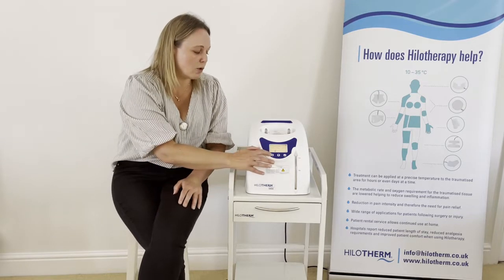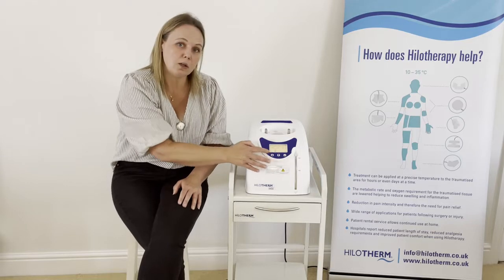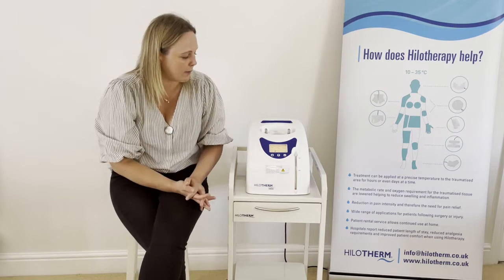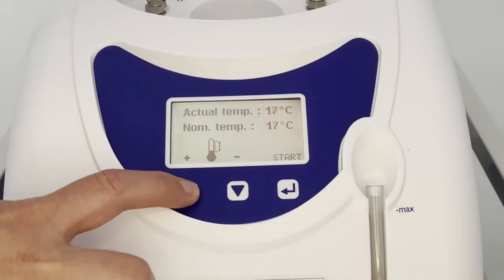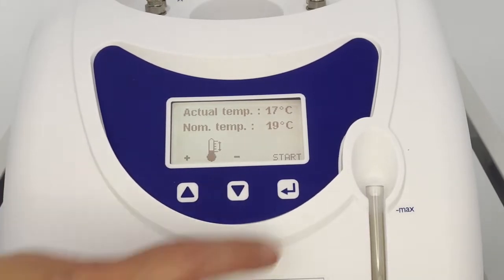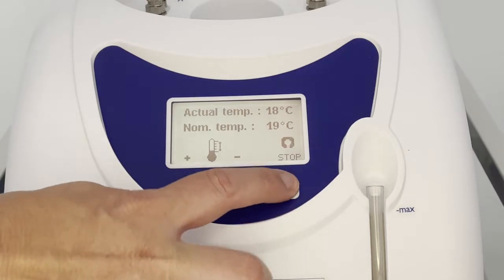You adjust the nominal temperature by increasing and decreasing it using the arrows. It won't work outside the overall range of 10 to either 35 or 38 degrees. You can also start and stop the water flow — that's the other thing available on the display.